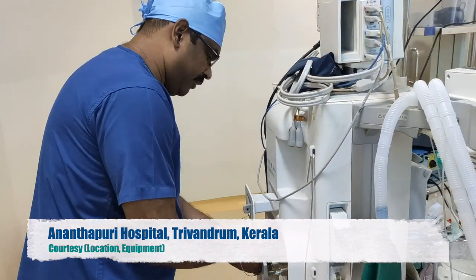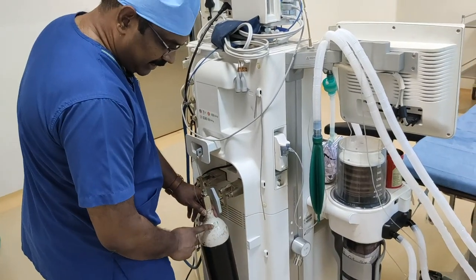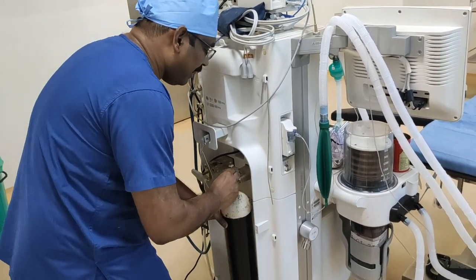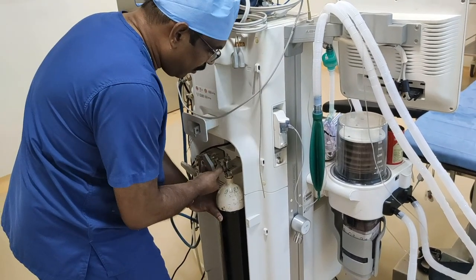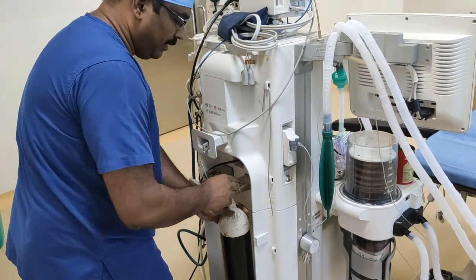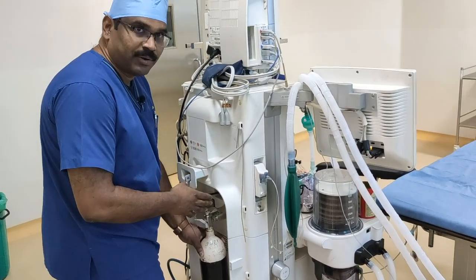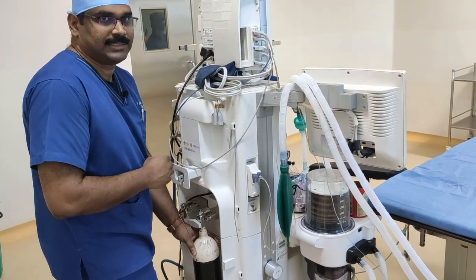So I am unmounting the oxygen cylinder. I can identify the oxygen cylinder by the color code. Now I will see the hanger yoke assembly for the nitrous oxide. I am unable to mount it because it is not fitting into the yoke. So this is what prevents the wrong connection of a cylinder to a wrong yoke, and this mechanical system is called the pin index safety system.